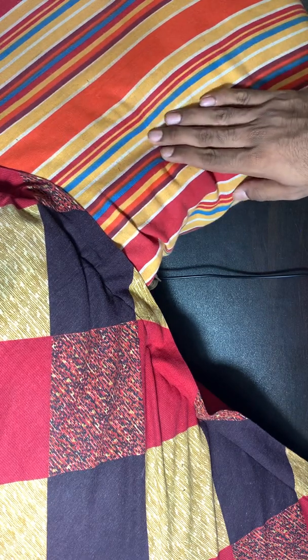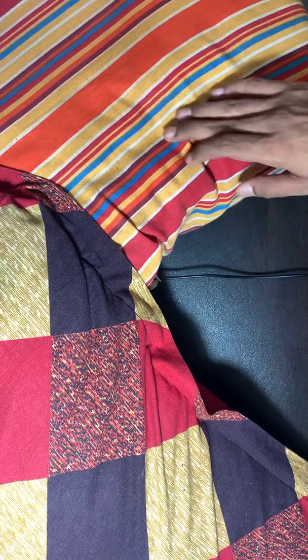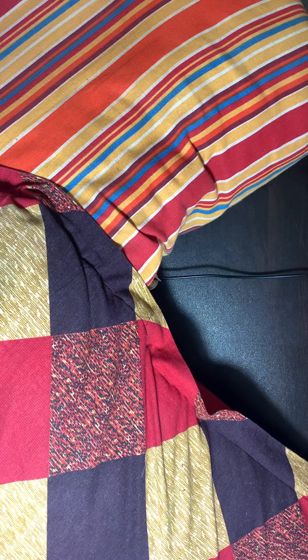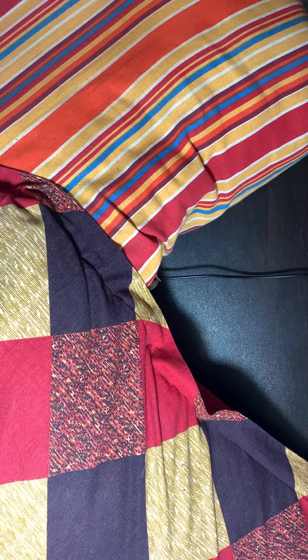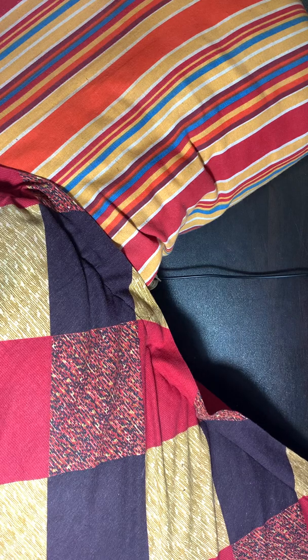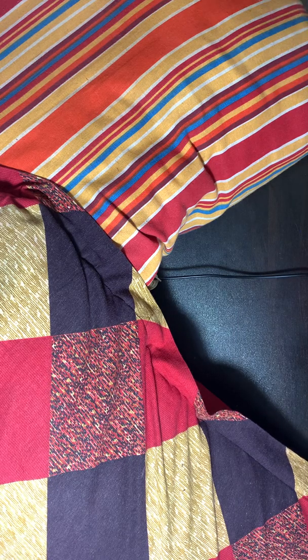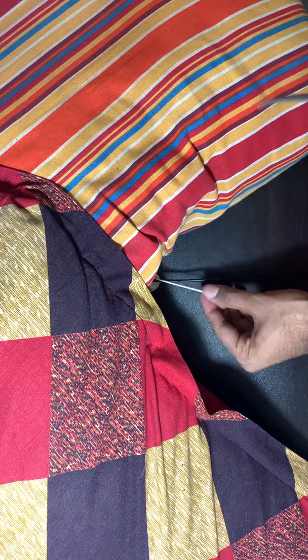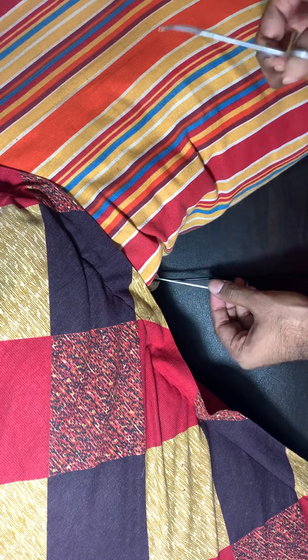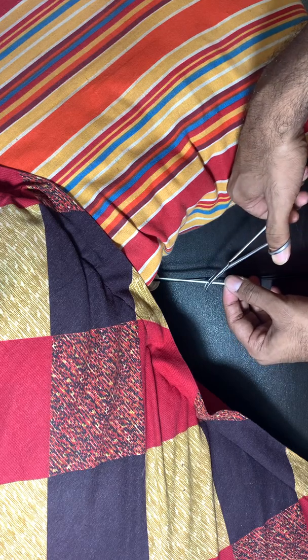If the placenta is not delivered spontaneously, then the controlled cord traction is applied. At first, we need to clamp the cord as near as the perineum as possible.